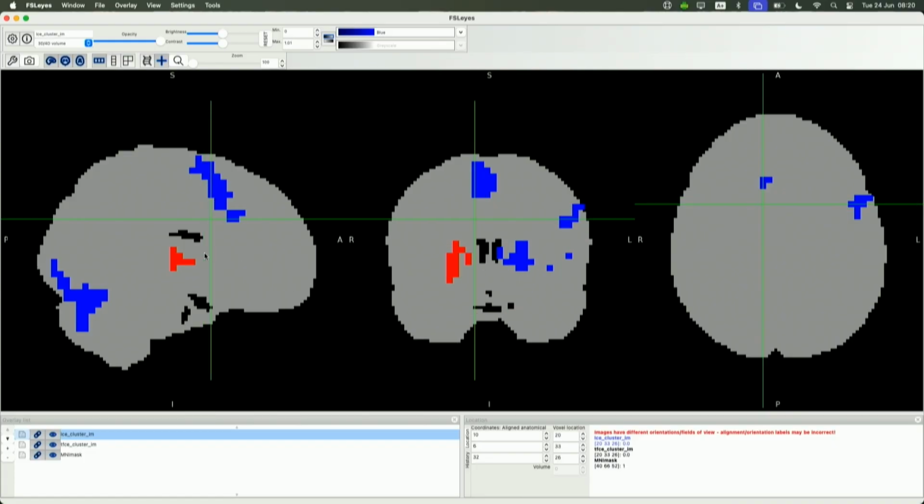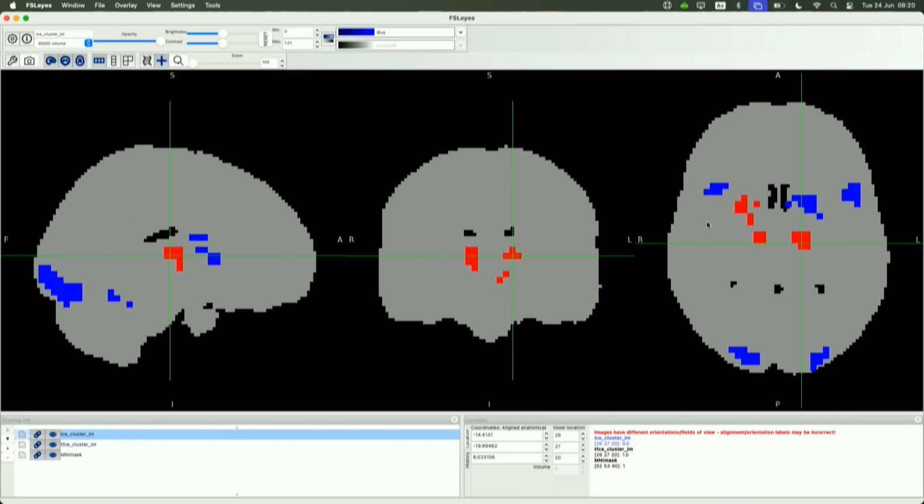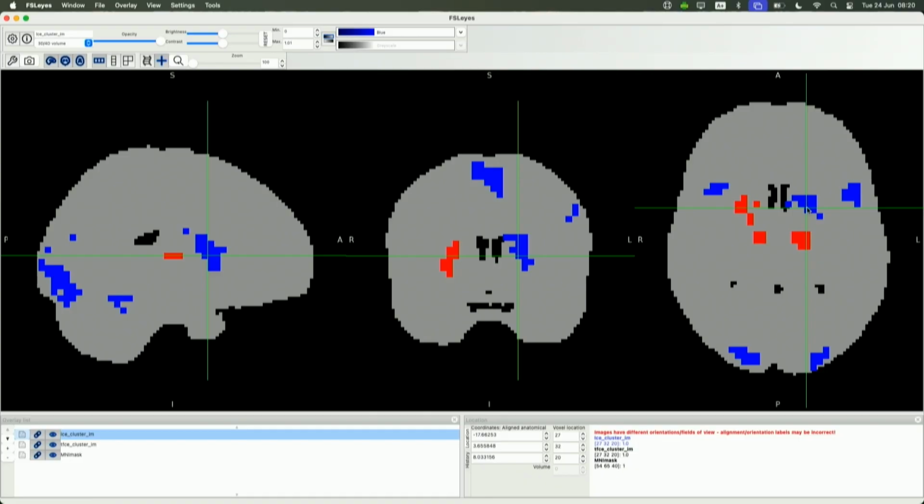So for example, for this region that we have here, we wouldn't say that there's enough evidence for any signal in there. So we would basically say that these were false positive regions and that the blue regions are the LCE significant regions. These maps are outputted and can be used for any further exploration. And I think that is about it for this.